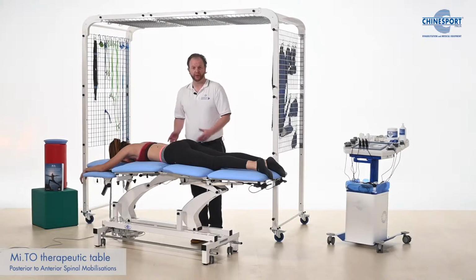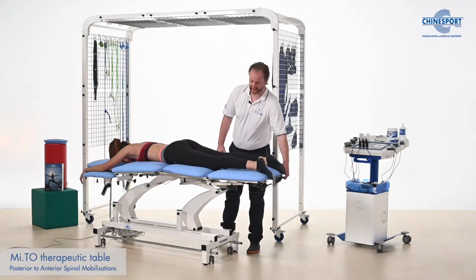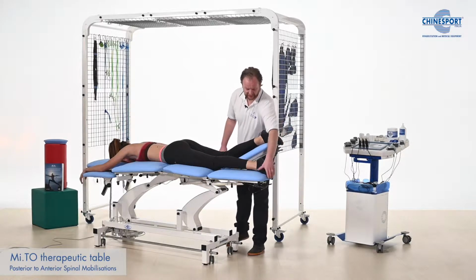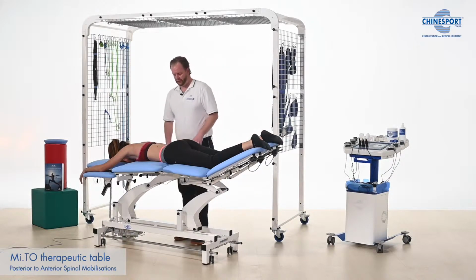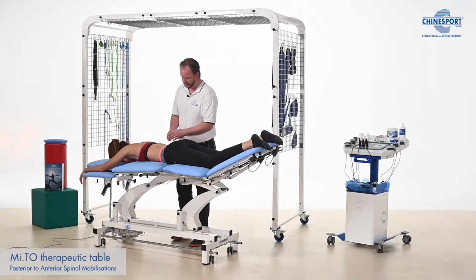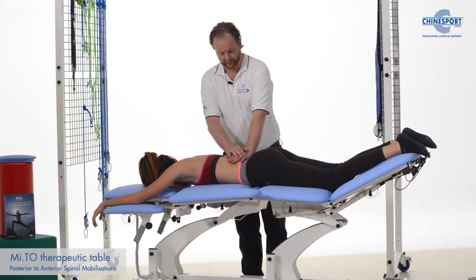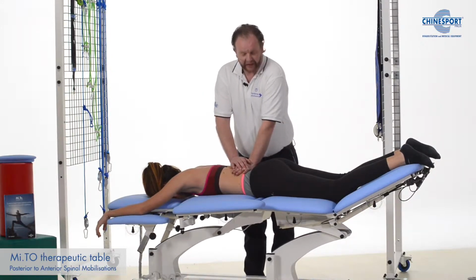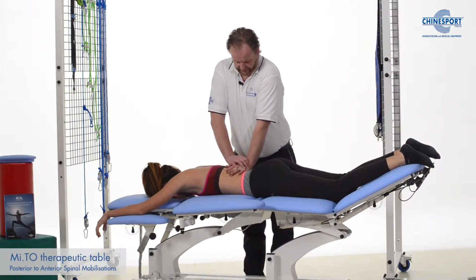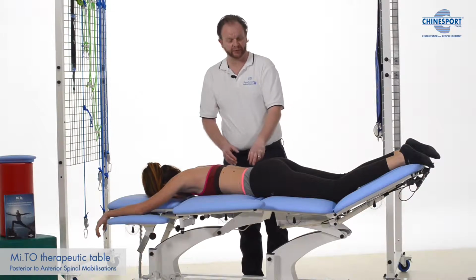With the patient in the prone lying position, we can focus more on manual techniques and mobilizing the patient. By lifting up here, we can take the neural tension off the posterior chains, and we can go into our spinal mobilizations, the posterior to anterior mobilizations. And we do that through the spinous processes or the transverse processes.